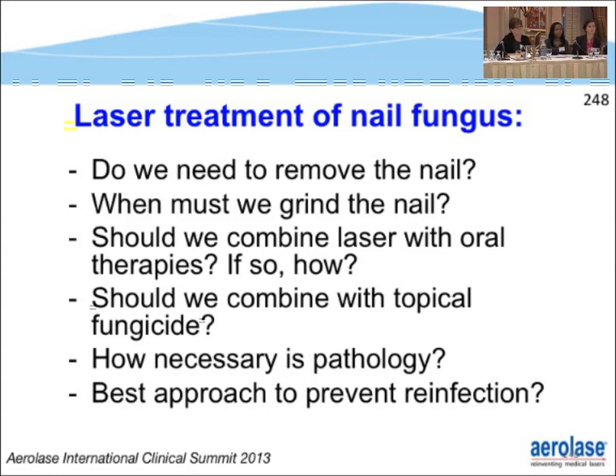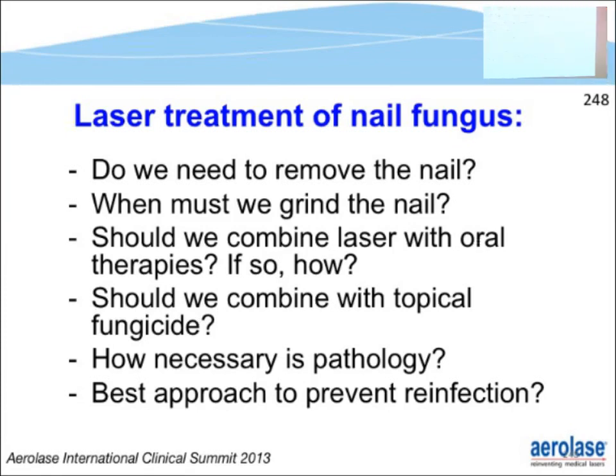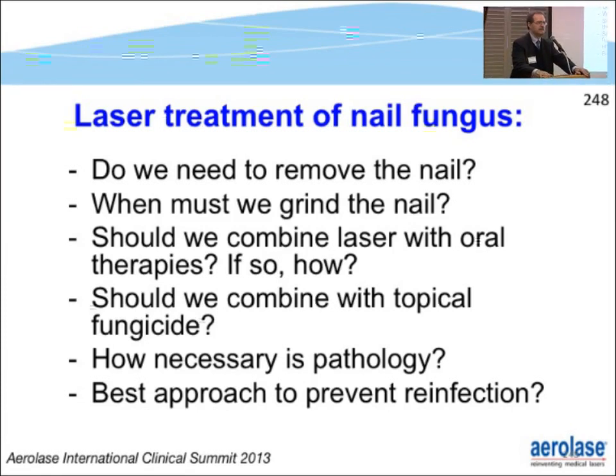Absolutely. Question. Okay, so we've started using the Neo also with great results. Though I do a very aggressive, you know, the 5mm, then the 2mm, and on the 2mm lens, I might do 2 or 3 passes on the dystrophic portions. And my patients are really good, but I have an ice pack under their toes, and I have one I hold on top on the foot I'm not doing. So they're kind of iced in between. They go home, they're fine, no problems. The results are good. I'm going to try the 1.5, though. I'm looking forward to that.